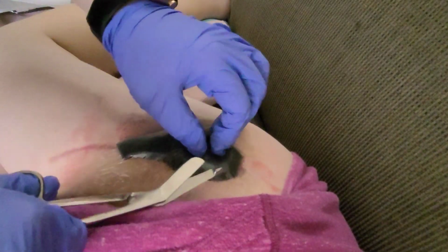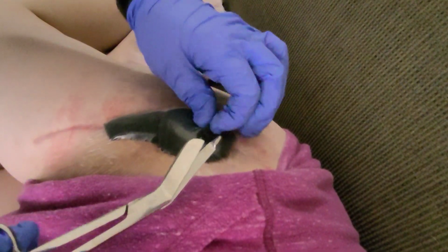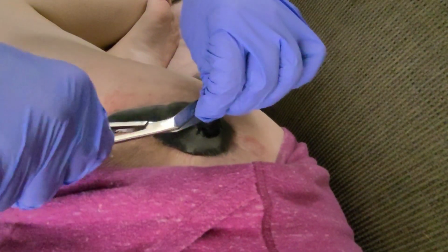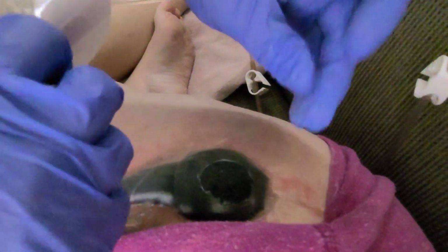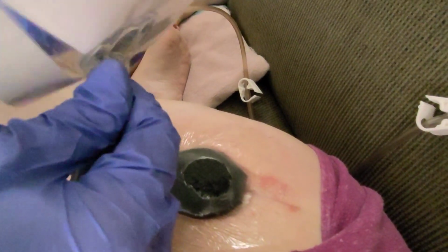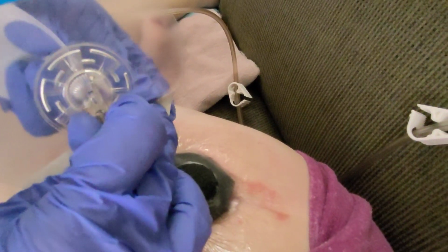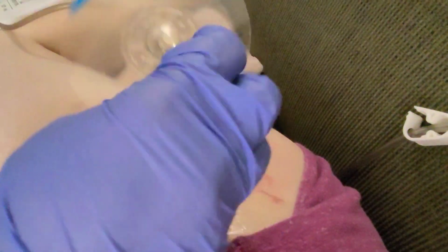So then she just needs to cut a small hole in the plastic because this is where she will attach that tube that I was showing you. It will go right on there, as you will see, and it will become vacuum sealed. So this is the last step in putting on the wound vac. After this is attached, all we have to do then is attach the hoses and press on the machine, and we are all done.